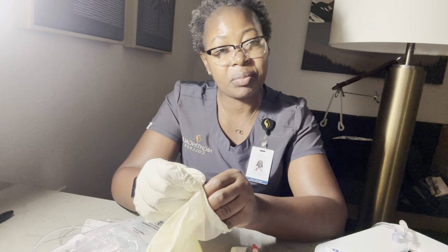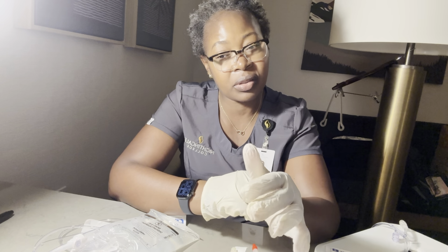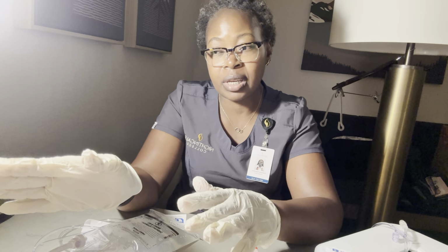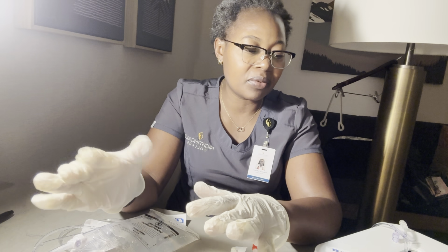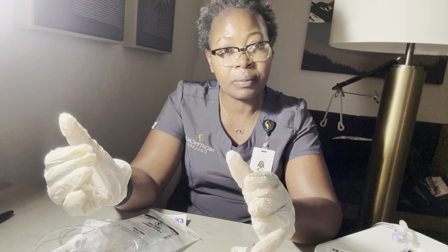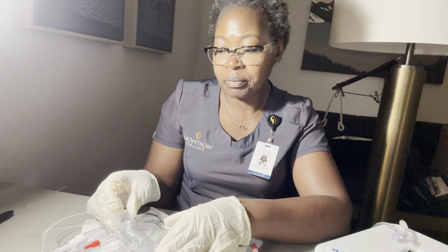I'll also confirm that my patient does not have any allergies to the medication that I'm about to provide, which is amoxicillin, and it's a high allergy medication. I will ask him to verbalize, and I'll also confirm from the doctor's orders. And he verbalizes that he doesn't have any allergy. So then I'll go ahead and spike and prime my tubing.